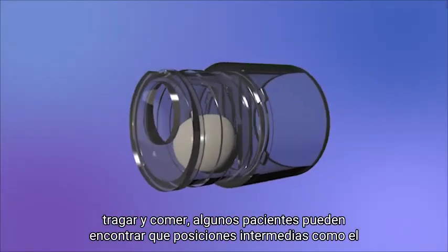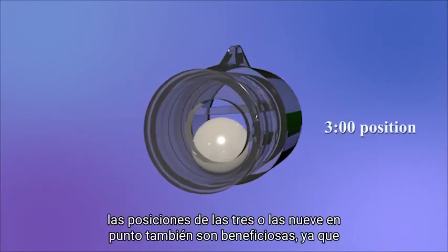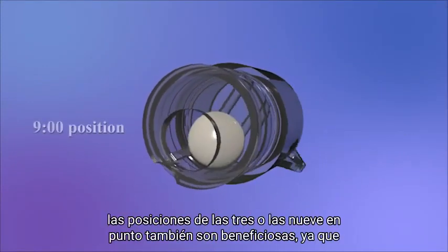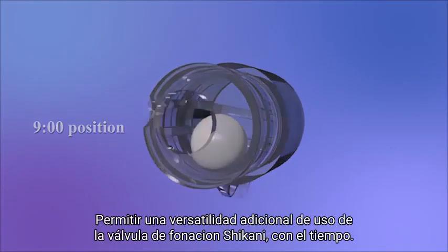Some patients may find that intermediate positions, such as the 3 o'clock or the 9 o'clock positions, are also beneficial as they allow an additional versatility of use of the Shikani speaking valve.